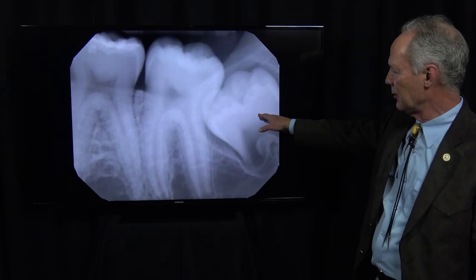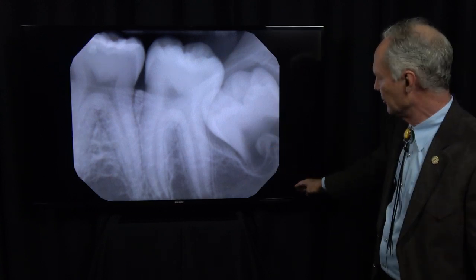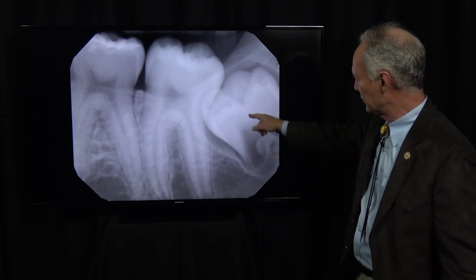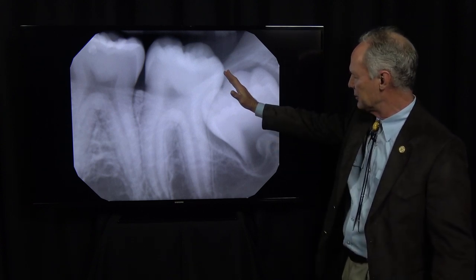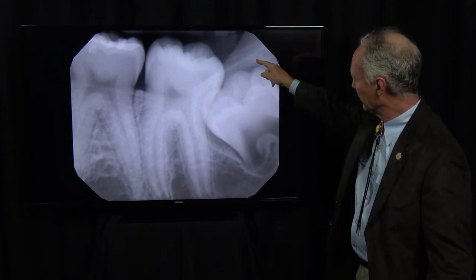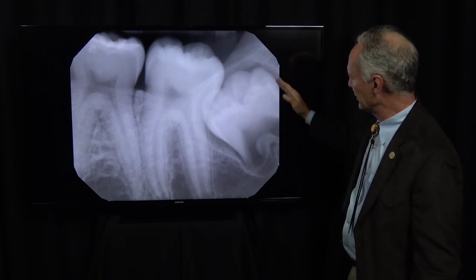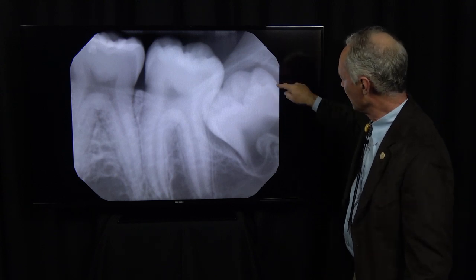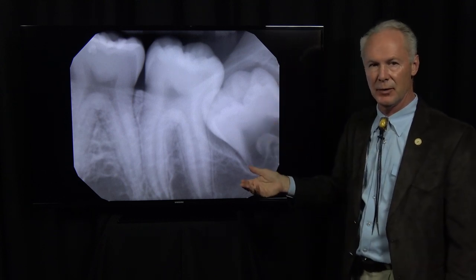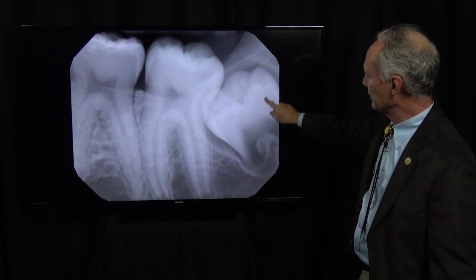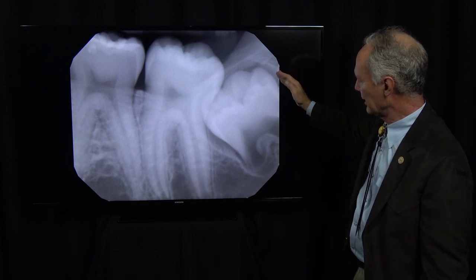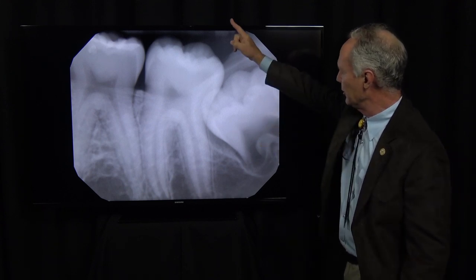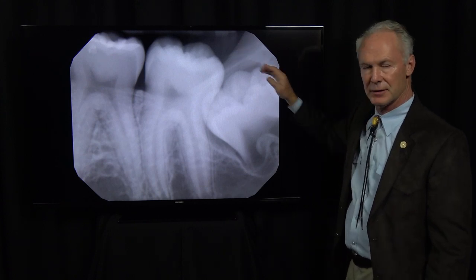Now for the lower left impacted wisdom tooth. My cut through the tooth is going to be from the occlusal surface to the furca in the direction of the long axis of the tooth. Then I'm going to create a space on the distal of the tooth — you can either remove bone on the distal or remove tooth, but I try to remove more tooth than bone because you're removing the tooth anyway. You've created a space to elevate that piece into. If you don't do that in a case where the tooth is completely impacted, it's going to be hard to remove this piece.